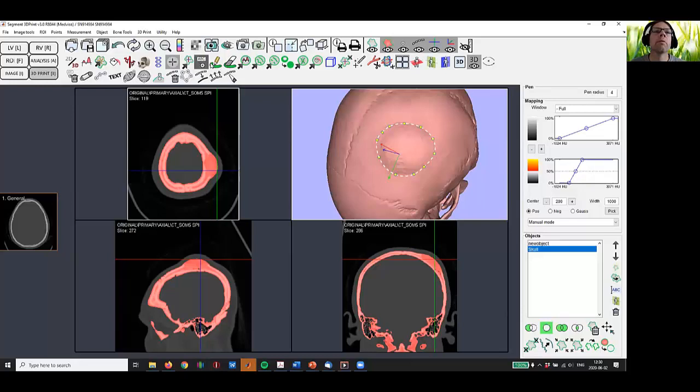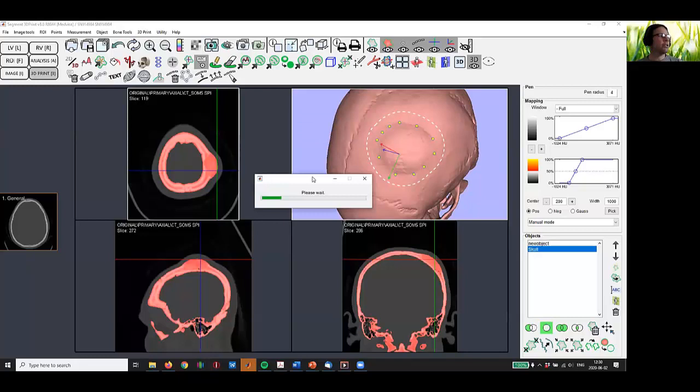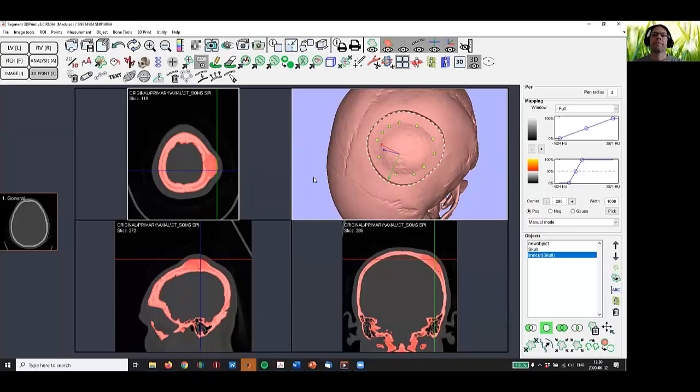adjust it. And now we want to have some safety margins. So I ask the computer to put it out 10 millimeters. And we can ensure that this line is snapped down. Now we'll cut along this line. So I'm much faster than neurosurgeons cutting. So we get the new part where there's a cut.